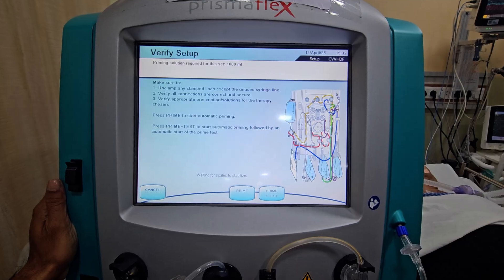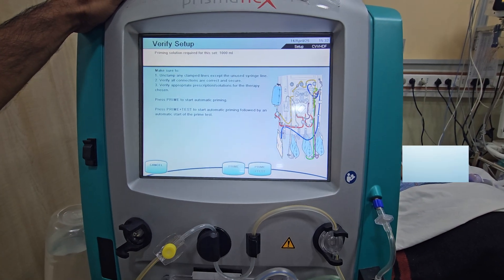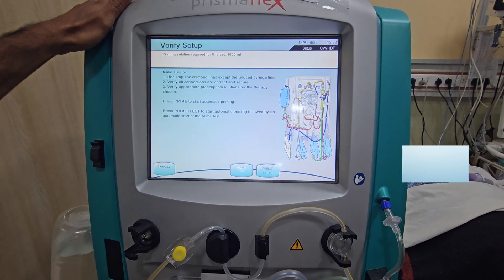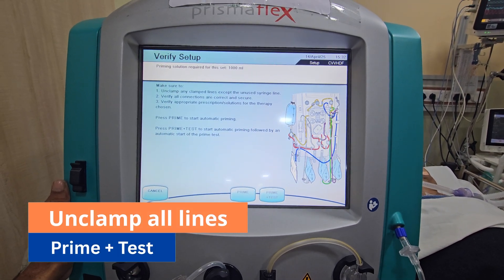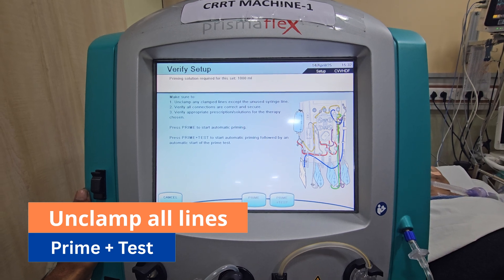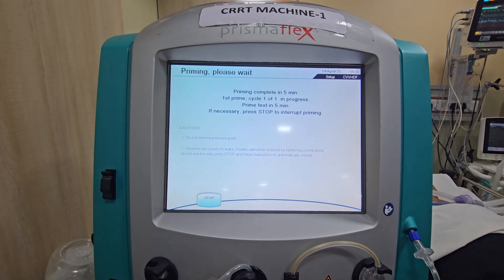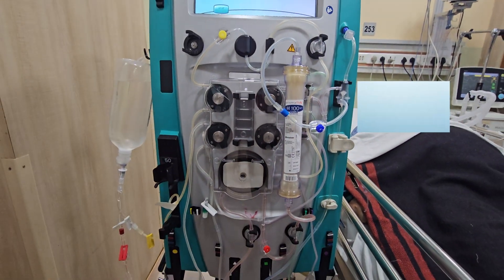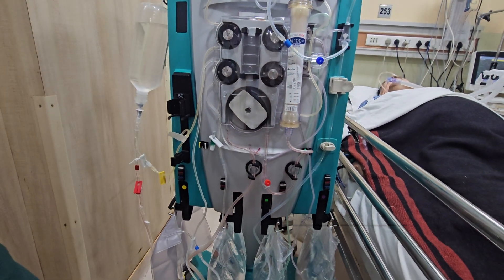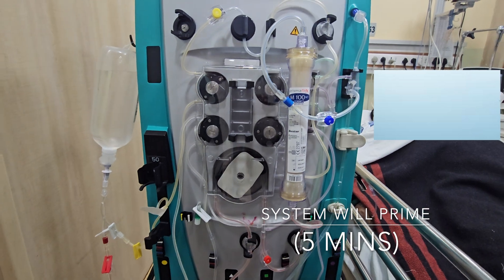Now it's ready. Unclamp all lines and press Prime Plus Test. The system will prime with normal saline. It will take around 5 minutes.